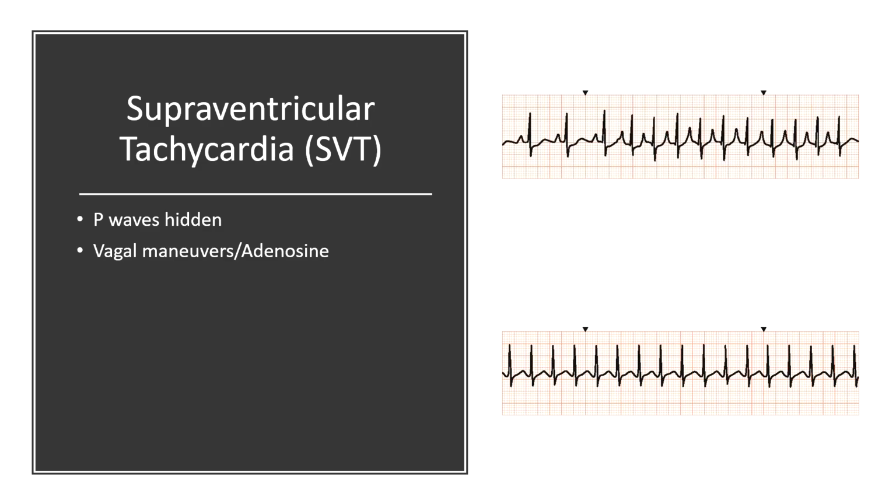And you're not able to see, like, is that a P wave or is that the QT? So what's exactly happening in the middle of that upper graph one? So it's going fast. That would be considered supraventricular tachycardia. You look at the lower one down, it's really hard to tell. Do we have P waves? Do we have that QT interval? They're all kind of blending together. So this is a narrow complex. So your QRS is narrow. We'll look at things that are wide in a little bit.